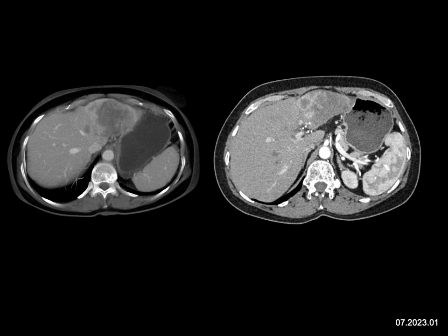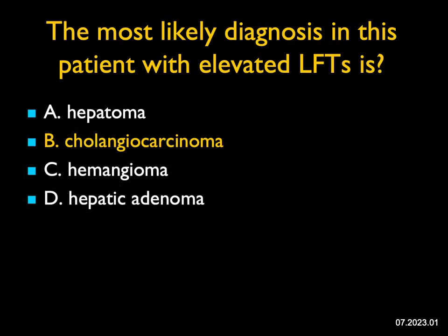Looking at the choices, it could be a primary tumor — hepatoma or cholangiocarcinoma. It's surely not a hemangioma; this is not the appearance of a hemangioma. If this were a hepatic adenoma, it would be one that became malignant. Hepatomas are usually in cirrhotic livers, and this liver is not cirrhotic. Also, hepatomas are usually hypervascular, and this lesion is not. So a hypovascular primary mass in the liver with maybe a little capsular retraction — the best bet is cholangiocarcinoma. And the answer here is cholangiocarcinoma.